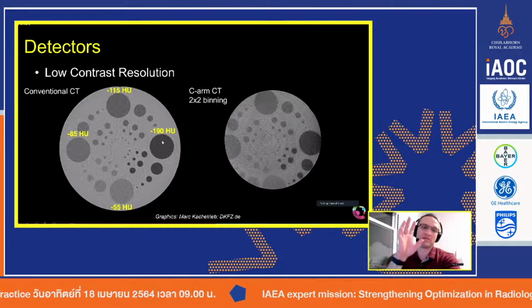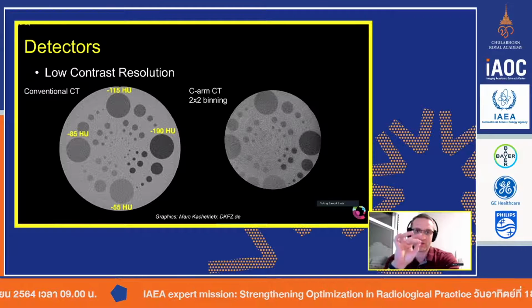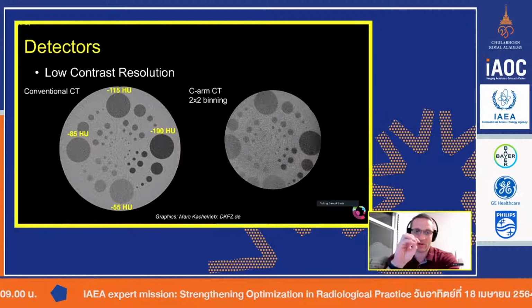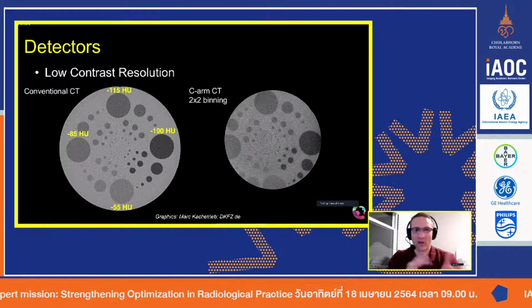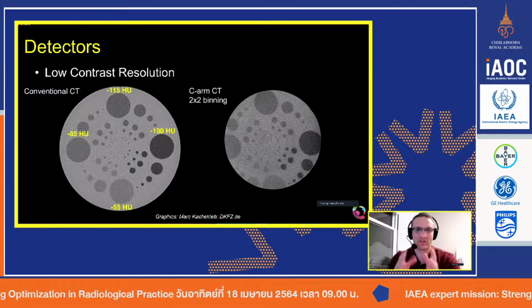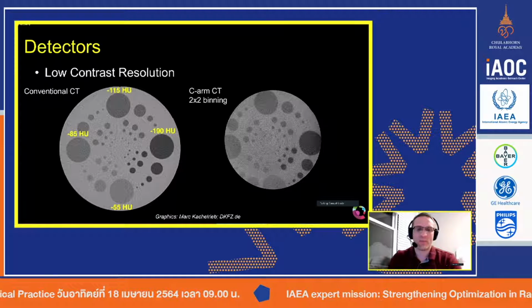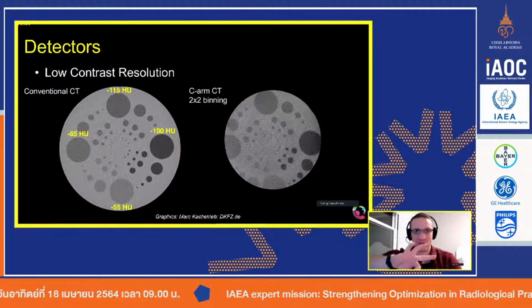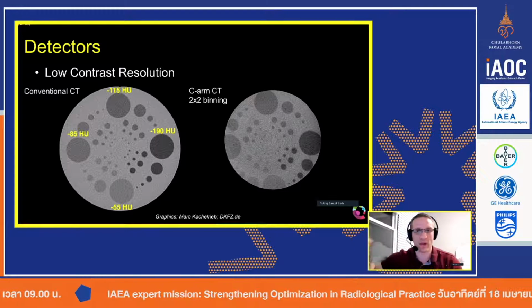Overall, spatial resolution, contrast, and noise in fluoroscopy are an interesting creature in the way we will optimize it. In the next talk, we're going to give you actual tips on how to physically optimize those effects. Those are the same three principles that we've been talking about in CT, as we will now talk about in X-ray and mammography.